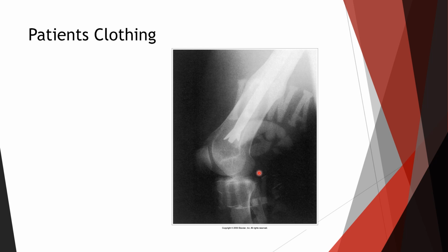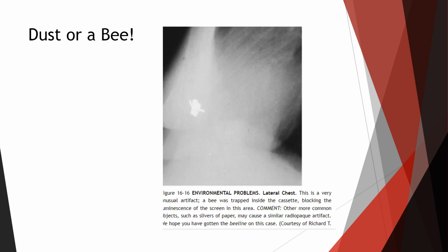Even if the lettering is not raised and thickened like this probably was, if it has some kind of shine to it, where maybe some kind of metal or other material is used to make it shiny, it's probably going to show up. So a lot of times it's safer to remove it, so we don't have to re-expose the patient.